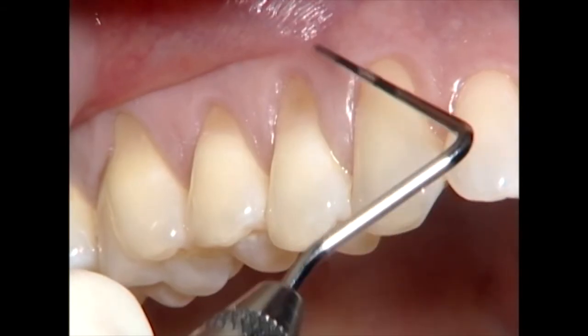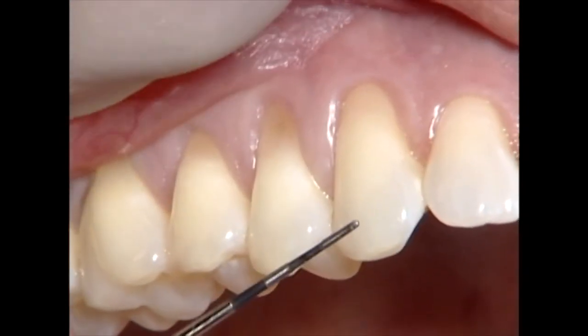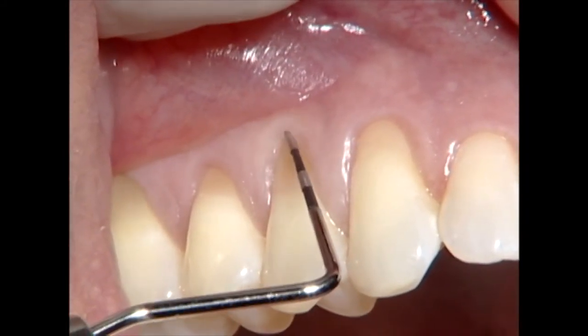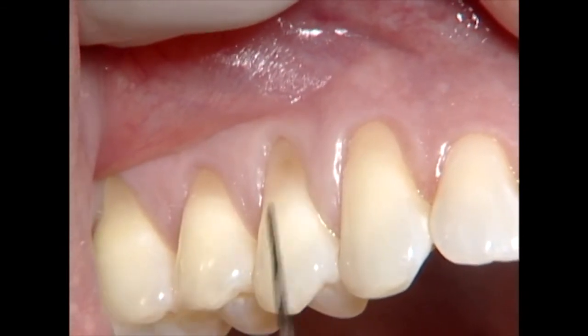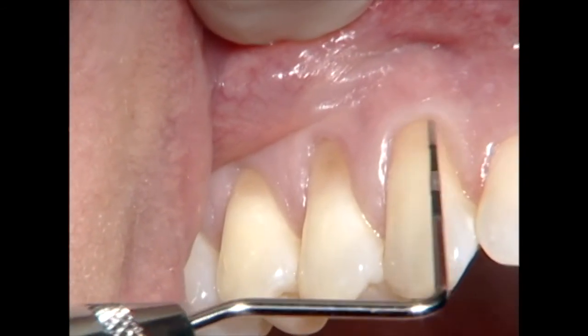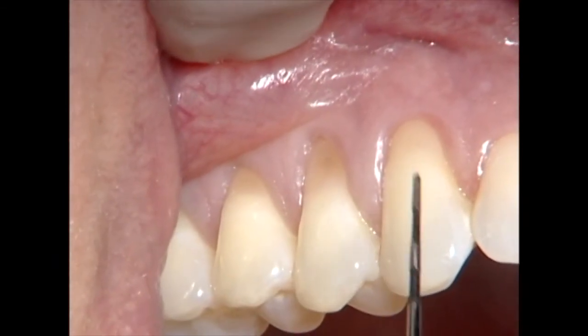Continuing to look at the gingiva, you can see the mucogingival junction here. Because I've already injected, it's pretty easy to see where the mucogingival junction is. There's minimal, if any, attached gingiva present facial to the premolar. There's a fair amount of attached gingiva — a good four and a half millimeters in vertical dimension at the canine, but recession in spite of it.